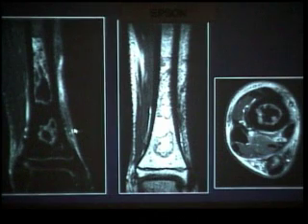Okay, so which one is external and which one is internal when you have the double line? You have one that is hyperintense and one that is hypointense, right? Do you understand the question? You have two lines. One is hypointense and one is hyperintense.